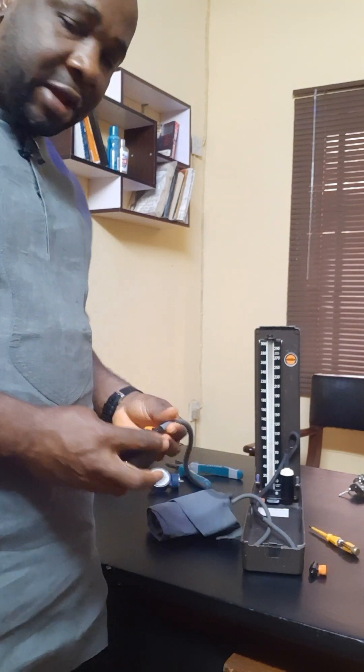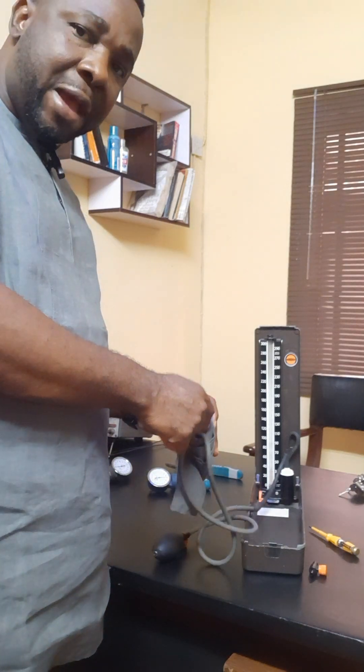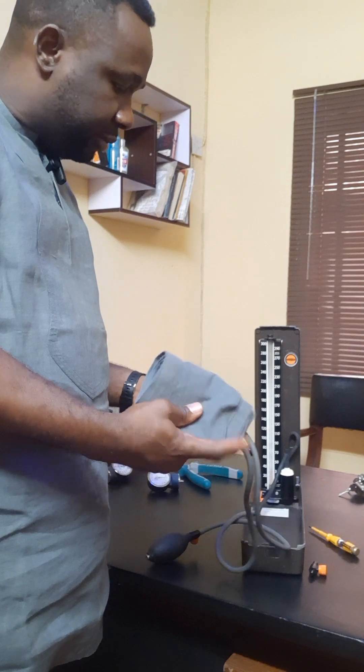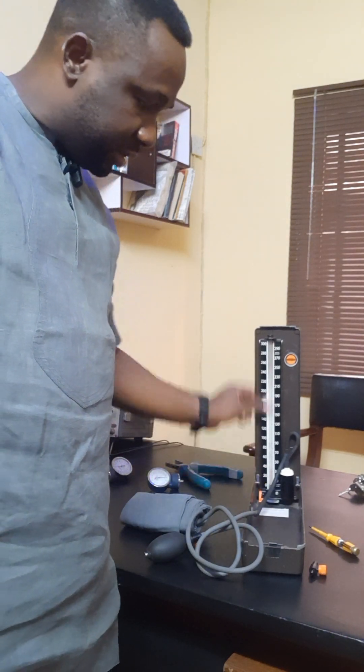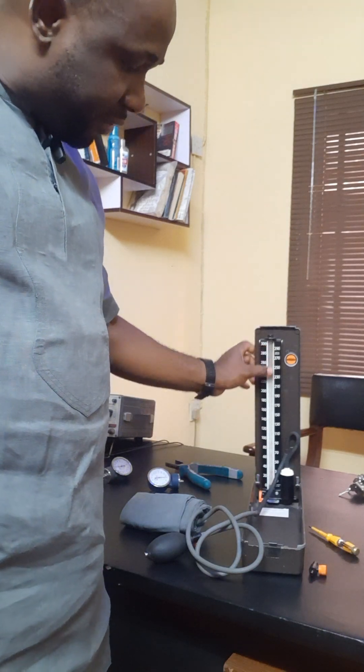Here is the air pump. The pump through this place. Then inside here is the air bag and this is the bag cover casing. Then you have here as the gauge. This is the gauge calibrated. Then you have the tubing.